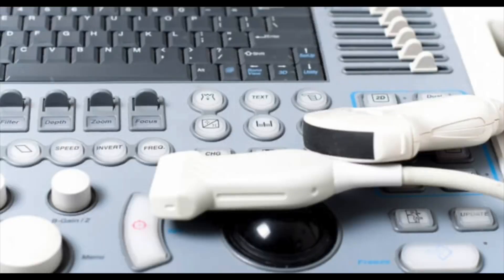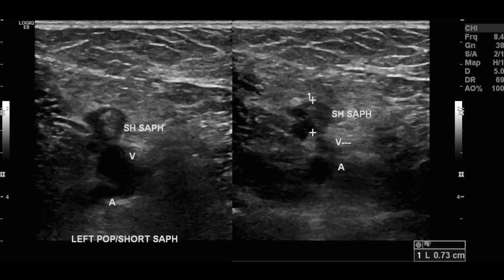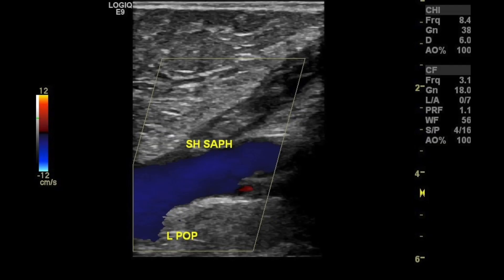If there's any artifact, I clear that out with the TGC. If there's a blood clot — which is usually echogenic thrombus, appearing slightly brighter in the vessel — I will measure that thrombus in transverse, show it in sagittal, then put color and Doppler on it. I will not augment if I find a blood clot or DVT, because you do not want to dislodge it. I have seen in forums that some people do not augment at all.